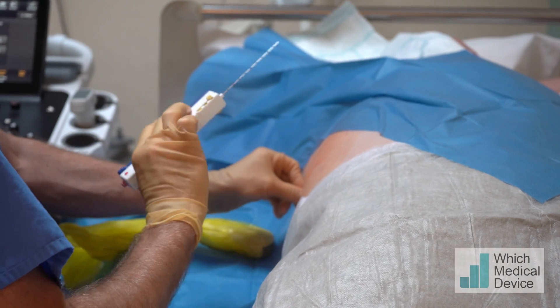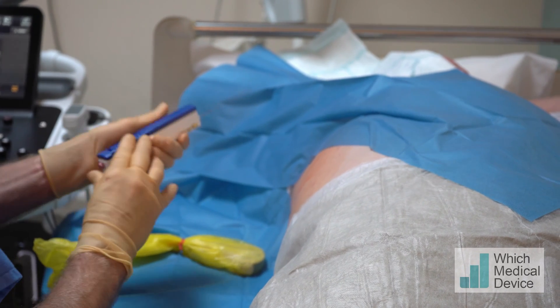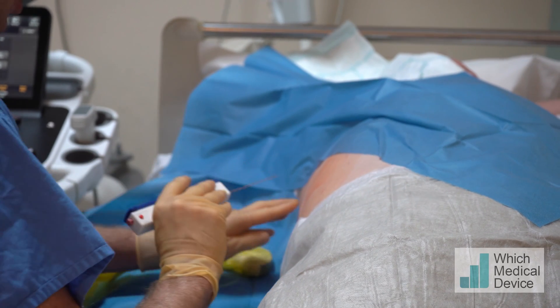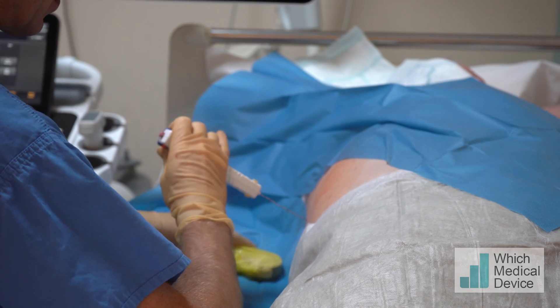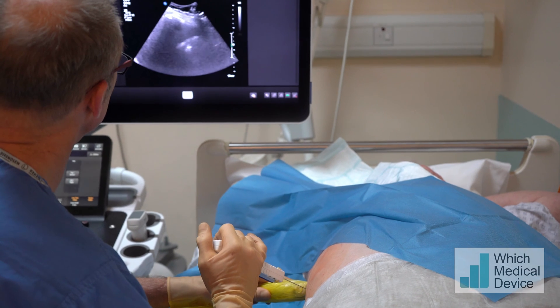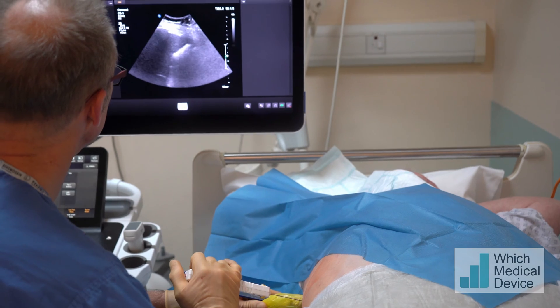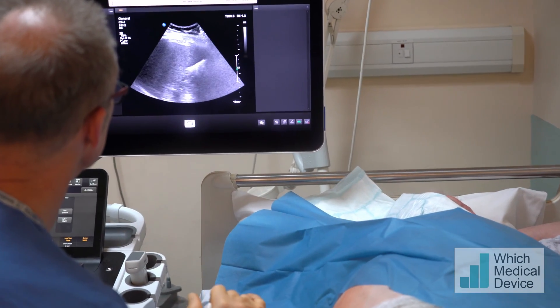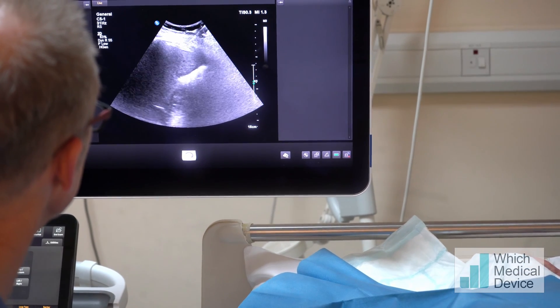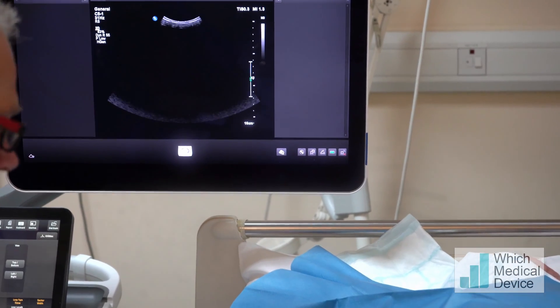This is a BioPince needle. We've set this to a three centimeter throw so we want to get a good sample. It's already loaded and we fire it with the end button here. Just going to reload that and pop it through the skin first. Then we're going to get our ultrasound lined up. You could actually do this without ultrasound guidance, but seeing as we have ultrasound it makes sense to use it. Just taking the same line as our local anesthetic. Just stop breathing there for me — bit of pressure now through the capsule. Fire — breathe away. That's the biopsy done.